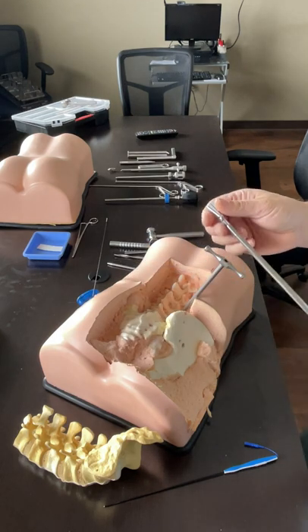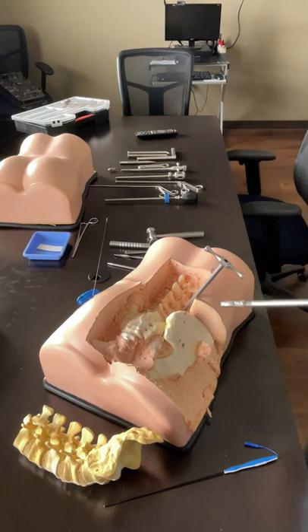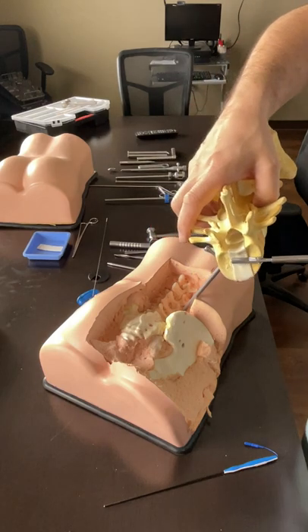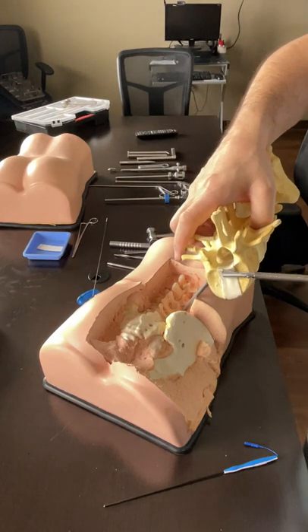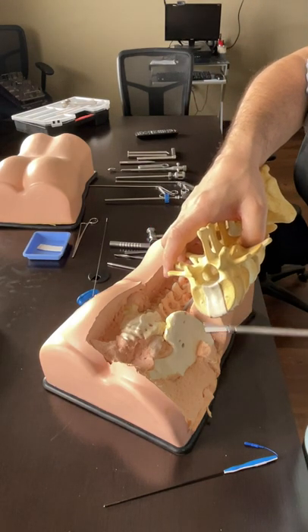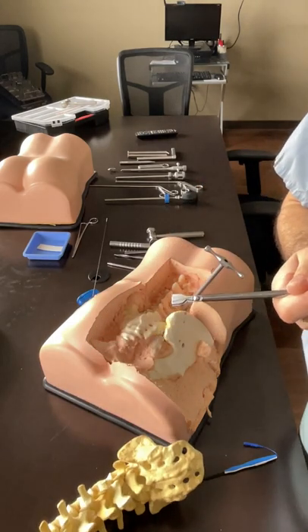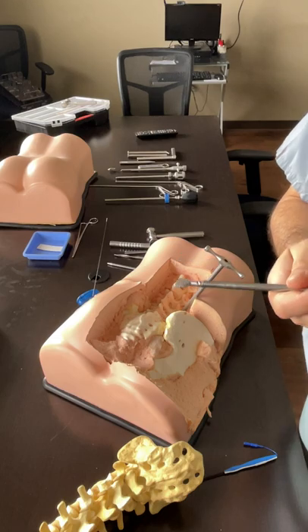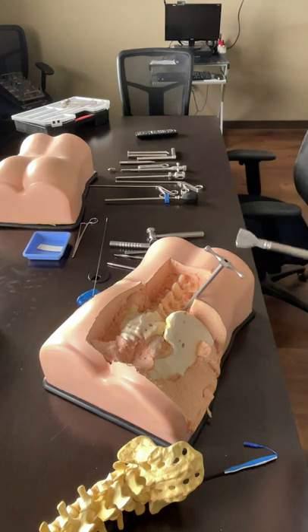What I do: I go in, aim at the disc base, open it, and then turn it a few times, then open it a little more, then turn it a few times again, and open it a little more - you can fan it as well. Apparently you are loosening the pieces.